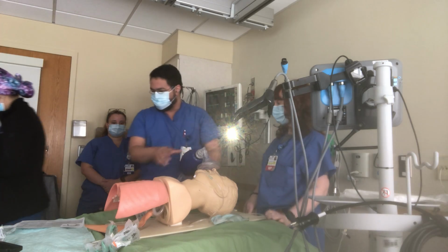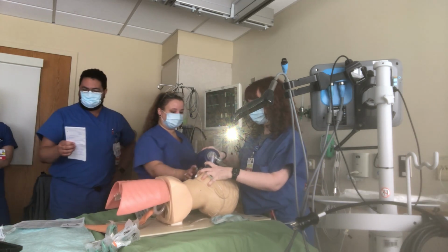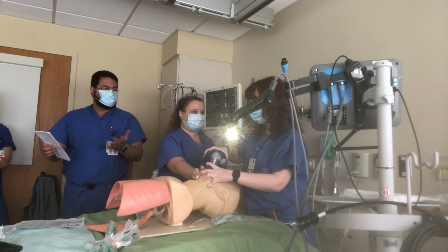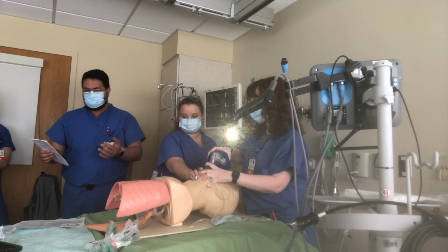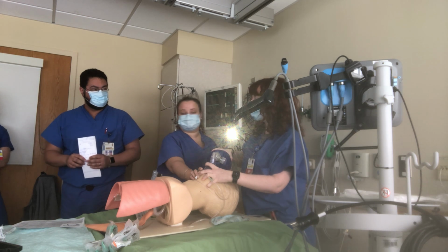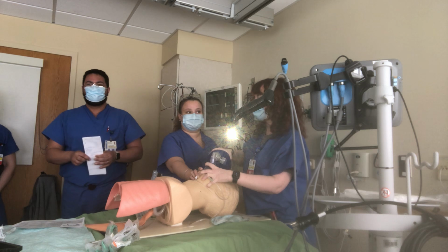Okay, so you're ventilating this. Amanda, help her, please. So now we're ventilating the patient, and we got the saturation barely to 92%. So the saturation is 92%, and he is difficult ventilation. We found out that he's a difficult ventilation, but we can ventilate now. Does this count as can't ventilate, or no?